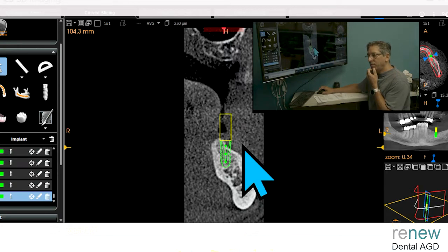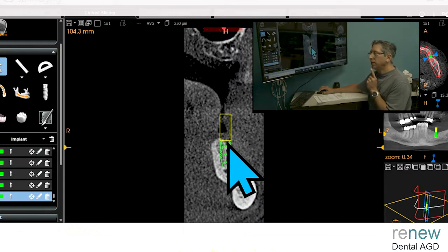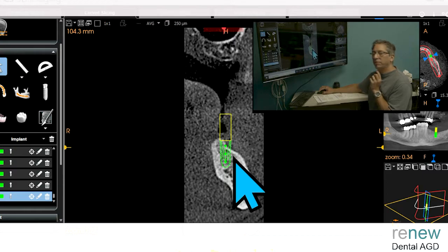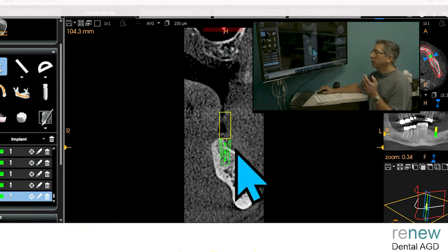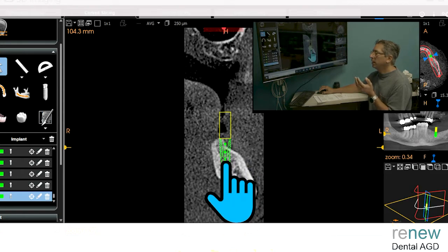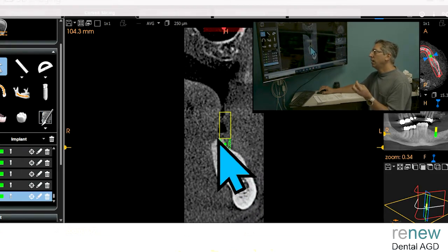It's a matrix that screws into the top of the abutment. I don't know if they still sell it, but it's a titanium mesh. This is a perfect case for this, where you want to build up this wall here. It's an abutment or a screw attachment that has a titanium mesh. You flap the tissue away here, you decorticate it maybe a little bit, and you put the implant in so the implant's fixed, and then you have the titanium mesh going across, and you fill it with particulate bone here. You just put that mesh and stop the mesh here, and then you suture it back over.